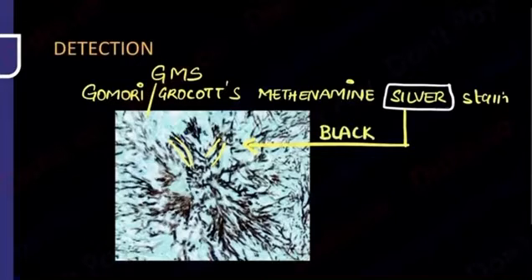Let me do a very quick recap. Do you remember in your pathology lectures, in melanin, have you done a melanin stain, M for M, melanin, Masson Fontana silver stain? Again, Masson Fontana silver stain gave what color? It gave a black color.